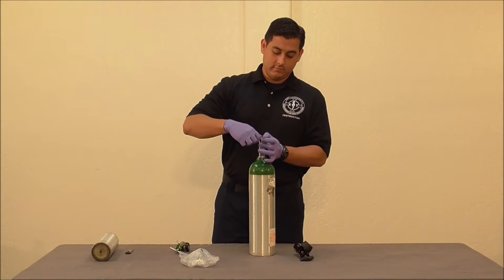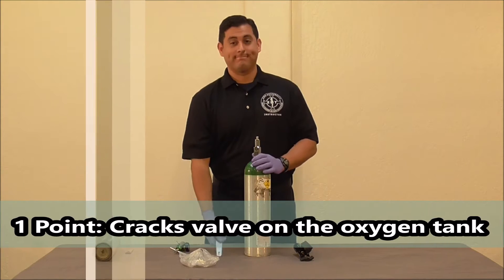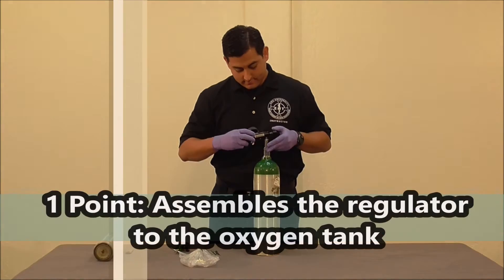The next step is to crack the valve on the oxygen tank. Then assemble the regulator to the oxygen tank.